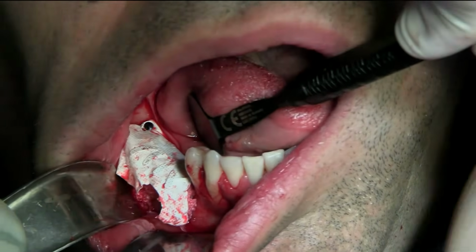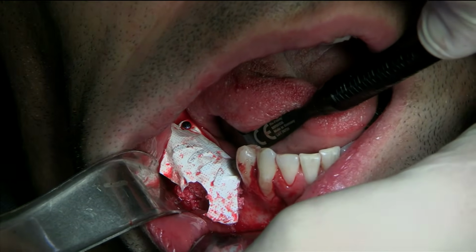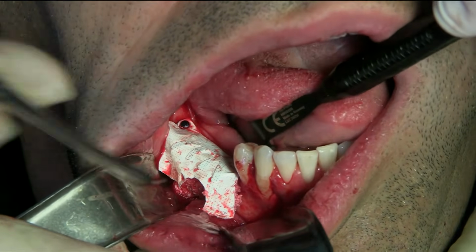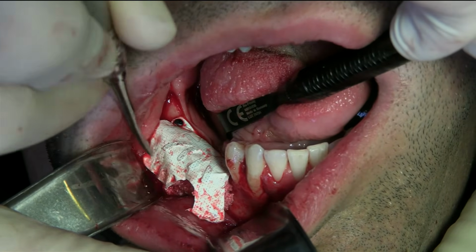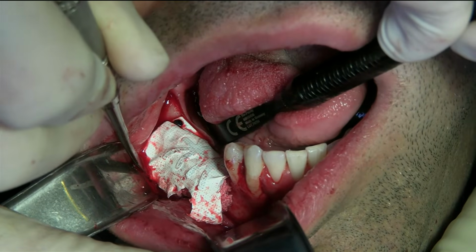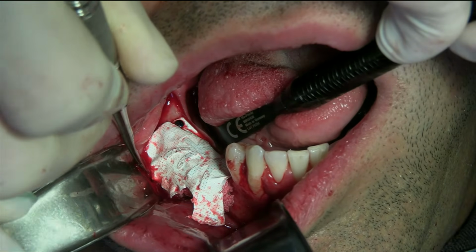Okay, a little bit to the left. I'll take this one. The front one you can let go, we don't need that anymore. Okay, give me a pin. So here we go. The bone is there, and I can put a tack somewhere here. You've got to hold this one. Perfect.